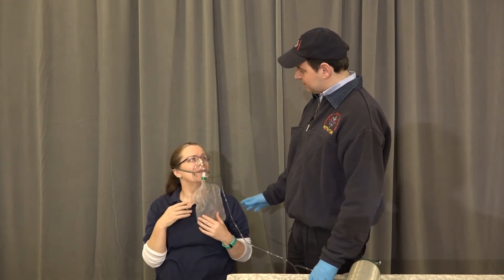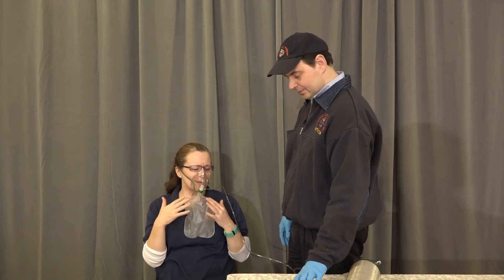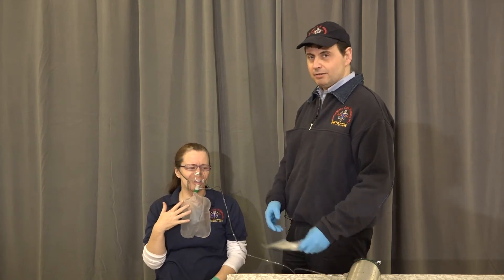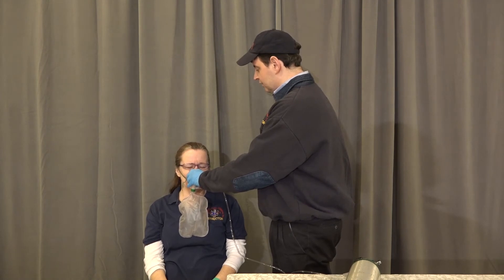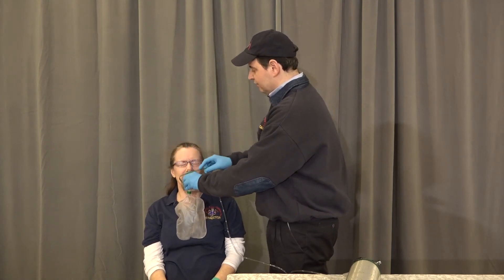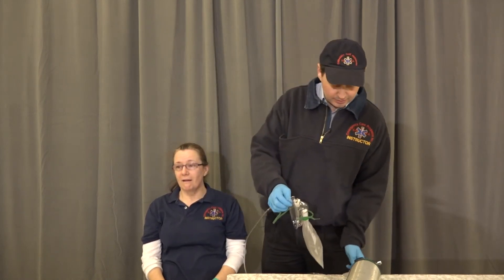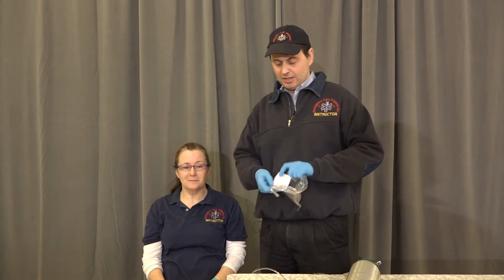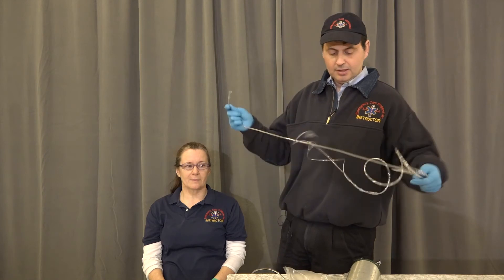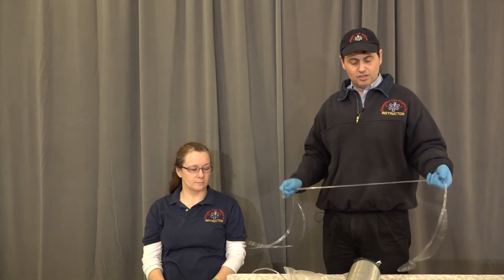If my patient is not tolerating the non-rebreather, what we're going to do is switch her to a different delivery device. We're going to take it off of her with the oxygen running, and I'm going to set her up on a nasal cannula and max it out at six liters per minute.